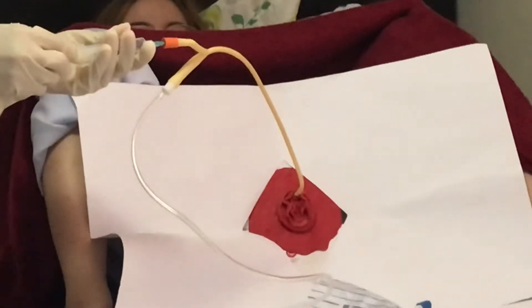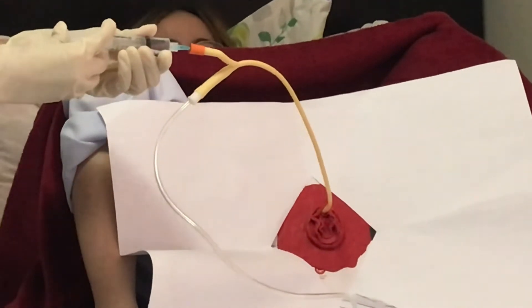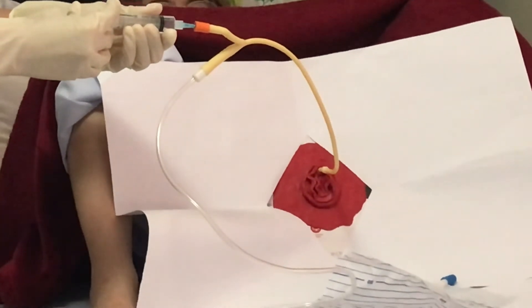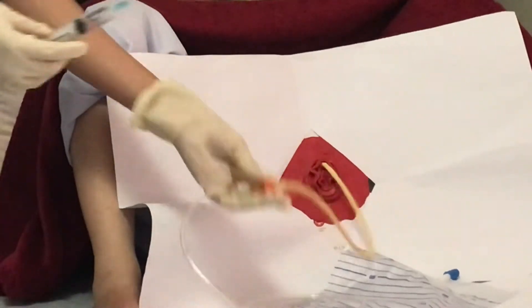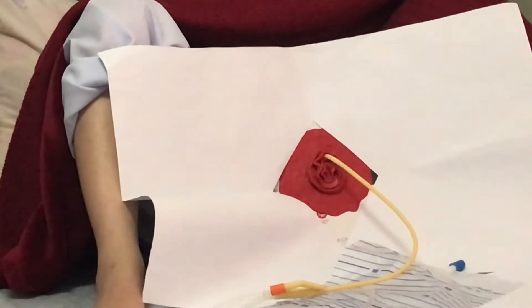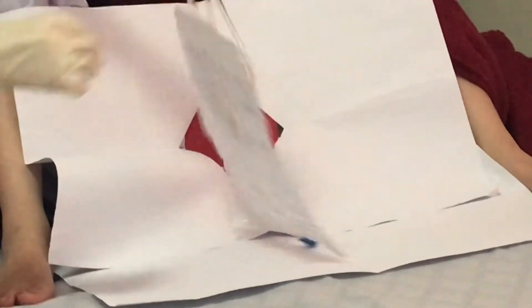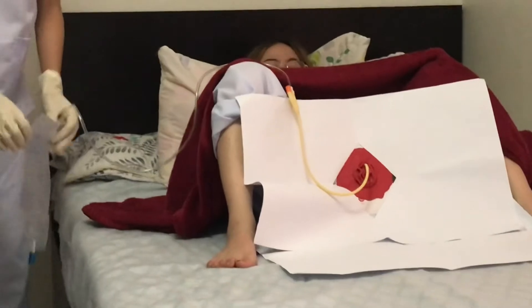Hold the catheter with the non-dominant hand. Use the sterile-dominant hand to fully inflate the catheter balloon. Then remove the syringe. Gently pull the catheter until resistance is felt. Secure the catheter on the patient's inner thigh with a securement device, strap, or plaster.